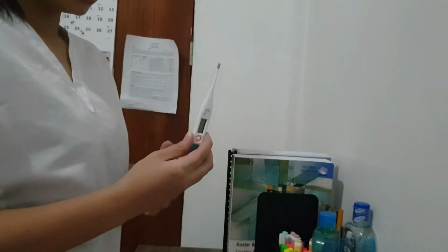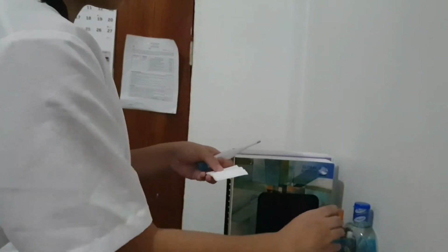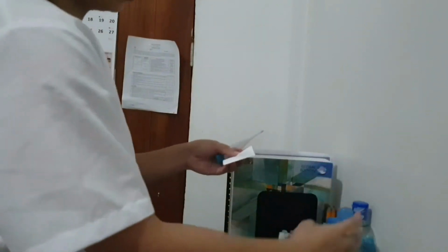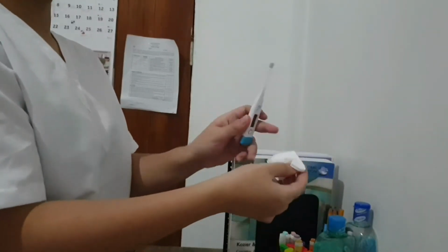After assessing the temperature of the patient, it is very important to clean the thermometer so that it will be disinfected. So this is how I will clean my thermometer. Okay, first I will get the cotton and then put it with alcohol. Okay, since it is already used, I will just clean it from the stem up to the bulb in a twisting motion. Okay, so now it is clean and it is ready to be used by other patients.